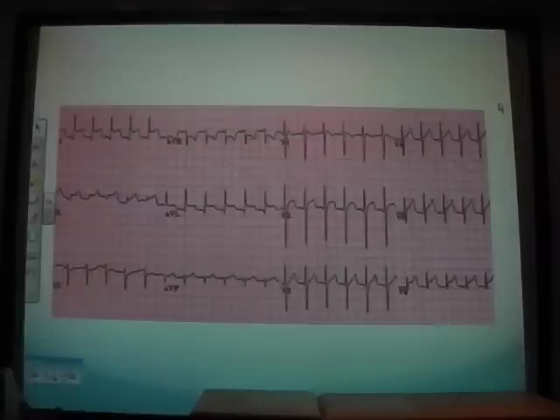Cool. And then I don't know whether it looked like it had early take-off. I don't have a picture of early takeoff on here actually, so this isn't early takeoff. Reason being, I want you to have a look at the isoelectric baseline between the S wave and the T wave and tell me if it's normal, raised, or low. And then I want you to have a look at the territories and see if it respects any of the territories, and if so, which ones.